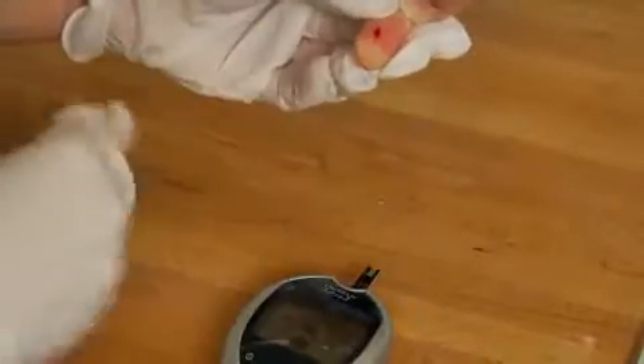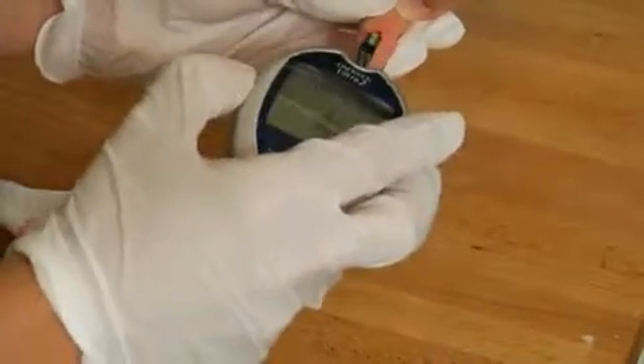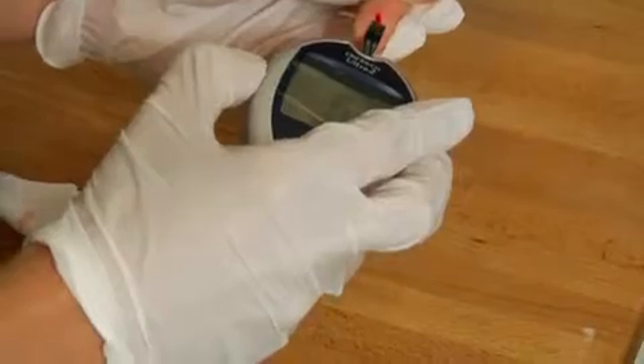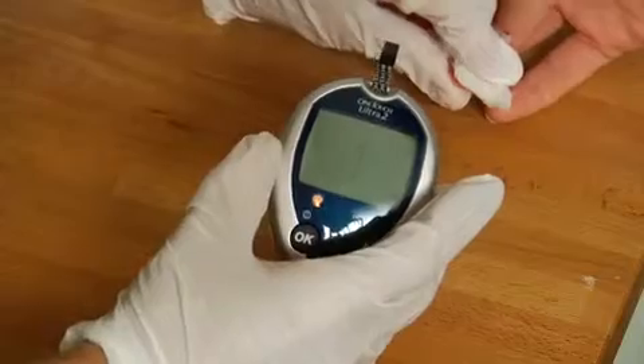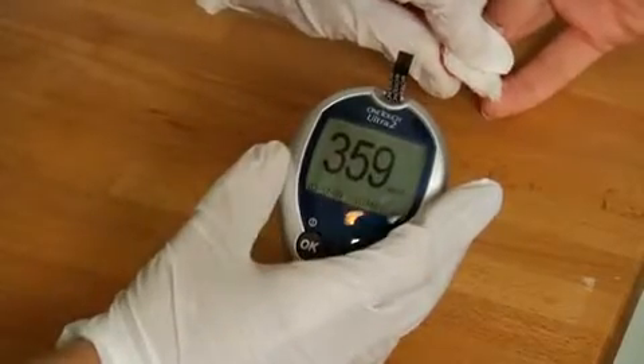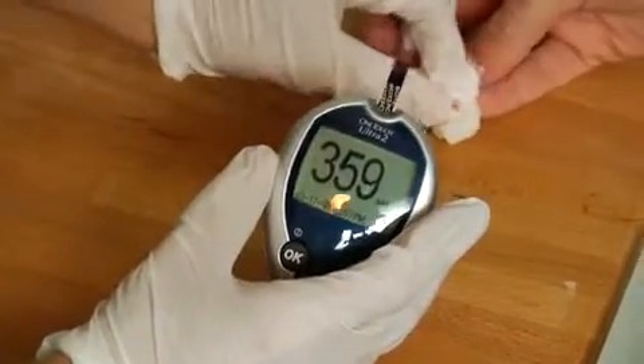Using the test strip that you've already made sure matches the monitor and is reading correctly — already inserted into your monitor — you're going to put the droplet of blood into the correct place on the test strip. Then you're going to wait. The test strip will be read by the monitor and it will deliver your blood sugar levels. And that's the basic way to use a glucometer at home.